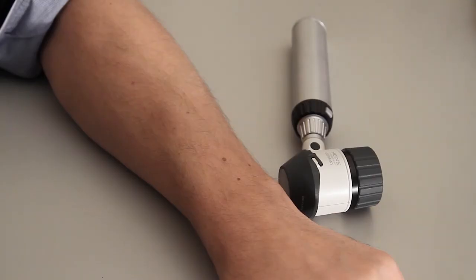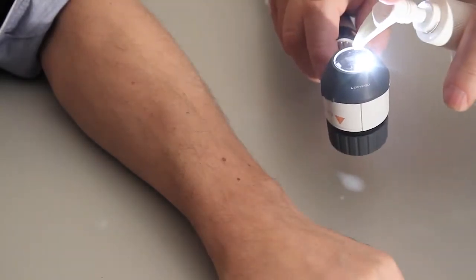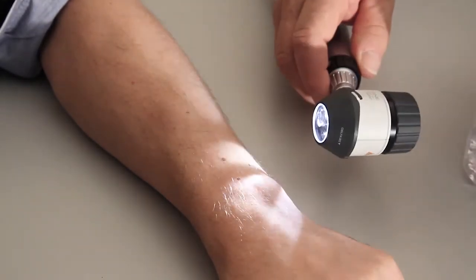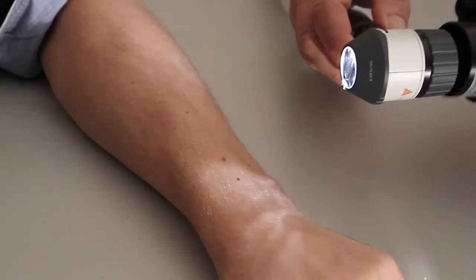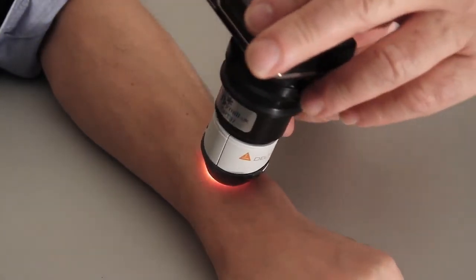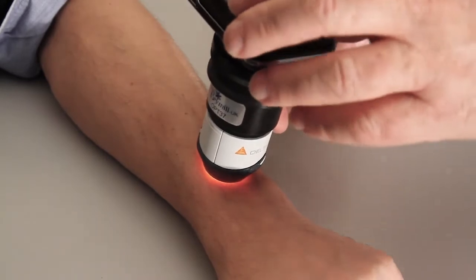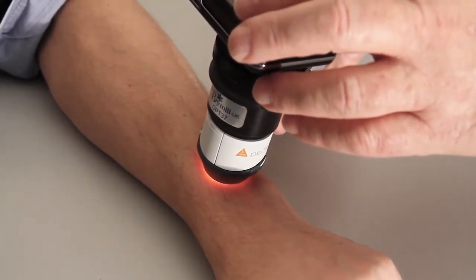Now, taking a photograph with the Heine Delta dermatoscope and the camera, turn it on and add a nice generous blob of the interface gel, because this is the non-polarizing plate. Attach the camera and twist it clockwise so that the ring is nice and tightly down onto the dermatoscope, and then look at the image through the camera to see that you're in the right place.